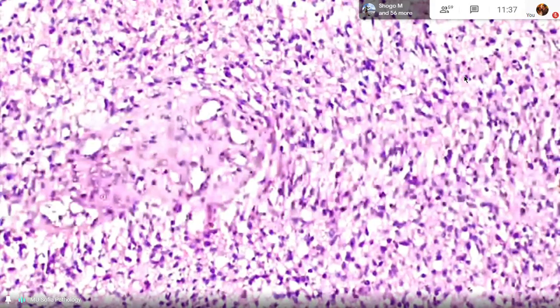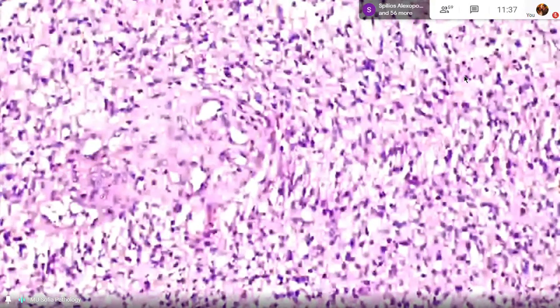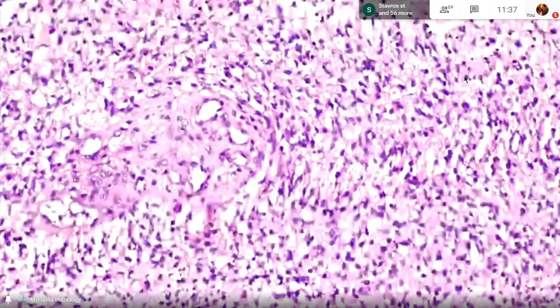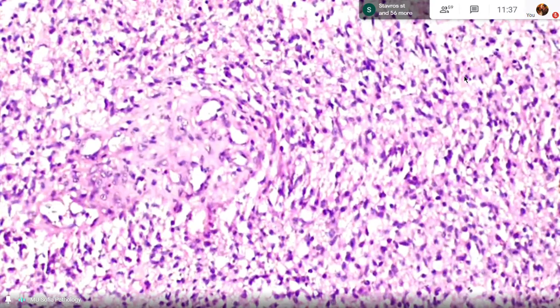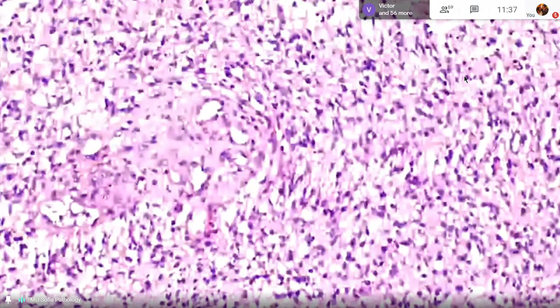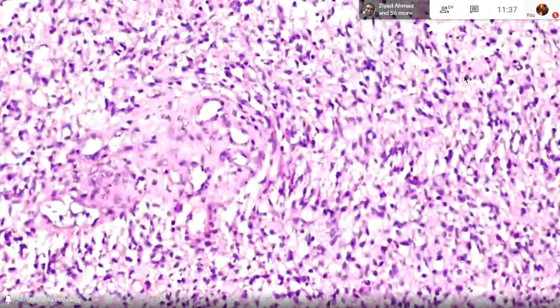Here another glomerular structure from the center to the right part, but looking backward, look at the arrangement of the nuclei with palisading, close to each other, with new formation, early stage of necrosis on the left part of this glomerular-like structure. Okay, these are the diagnostic criteria.